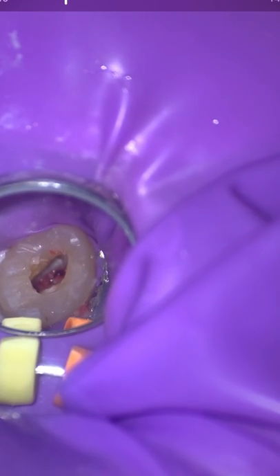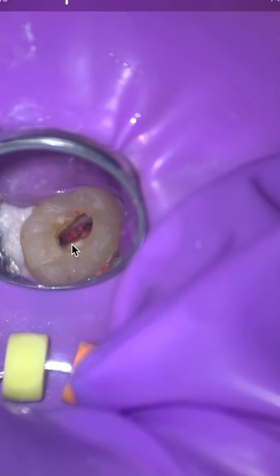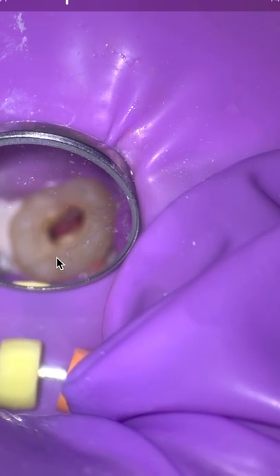But you've got to make sure that the bleeding is not from excess pulpal tissue remnants in the isthmus, or anywhere, and you never know if it's in the isthmus. So make sure you open the apical portion of the canal up significantly, because oftentimes my experience has been that palatal canals in maxillary teeth like this, and mandibular distal canals, will hemorrhage, especially if those pulps are hyperemic. There's hemorrhaging all over the place until you get rid of all that pulpal tissue.